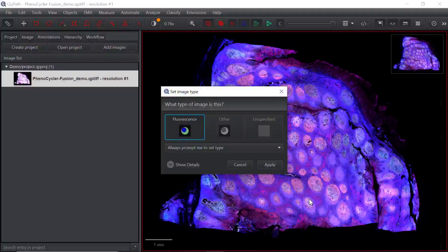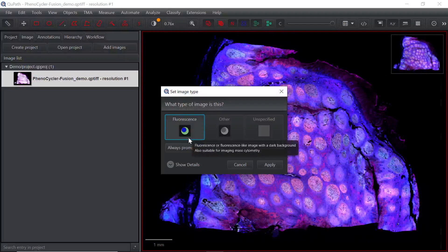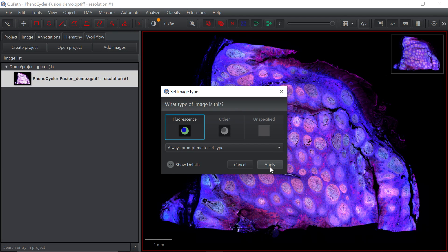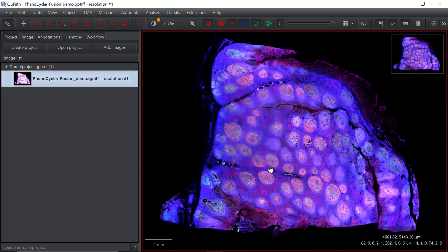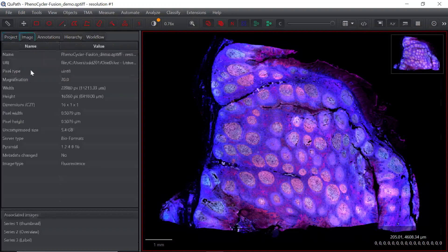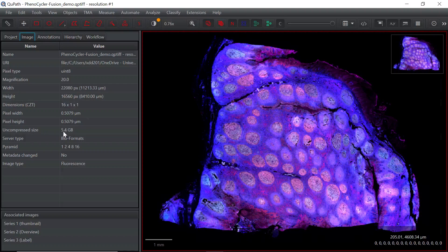QPath automatically detects the image format — it is a fluorescence image. If you have a bright field image, it automatically recognizes that too. We can click the play button and set the image type. You can click the image button to see the image information: the image name, save location, pixel type, magnification, base, height, size, and image type.